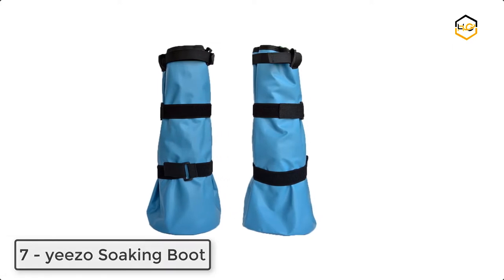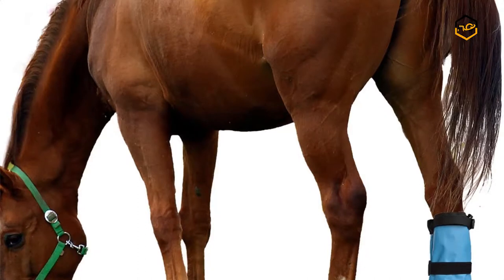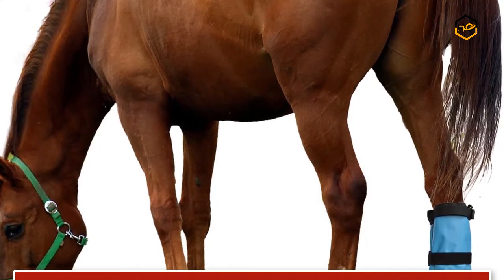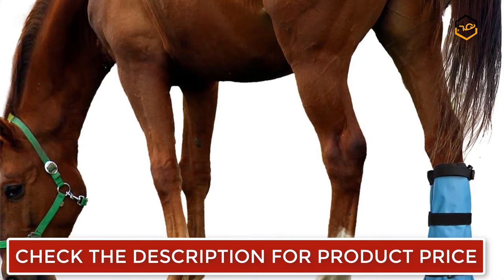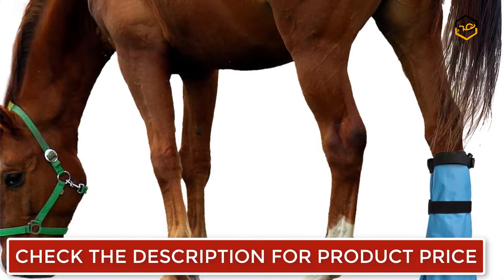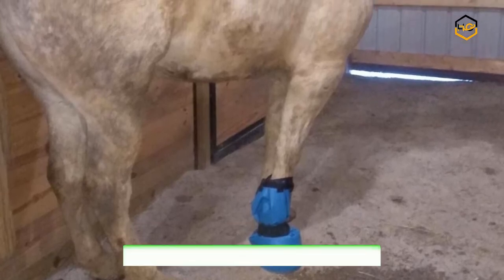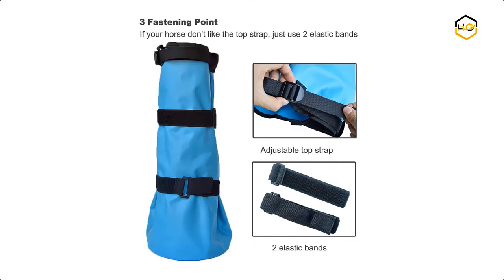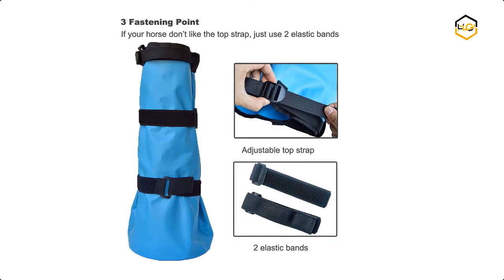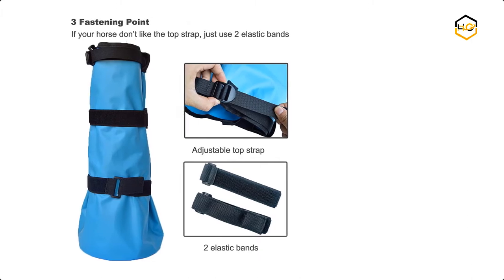Ranking at number 7, we have the Yeezo Soaking Boot. The Hoof Soaking Boot makes soaking, icing and treating common hoof ailments such as abscess, thrush, yeast, bruising, punctures, wounds and infections easier. It is lightweight and collapsible for easy storage, and suits hoof sizes up to 8 inches in diameter, fitting all hooves from draft to donkey. Made of durable 500D PVC tarpaulin with an enhanced bottom, it is washable and reusable, with 3 fastening points for a more precise and snugger fit on the hoof.